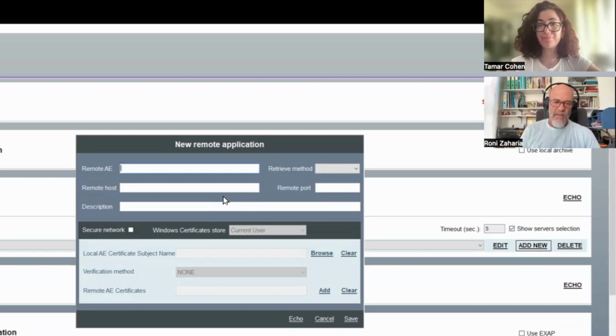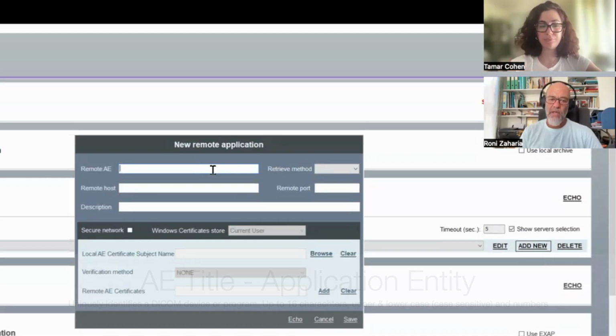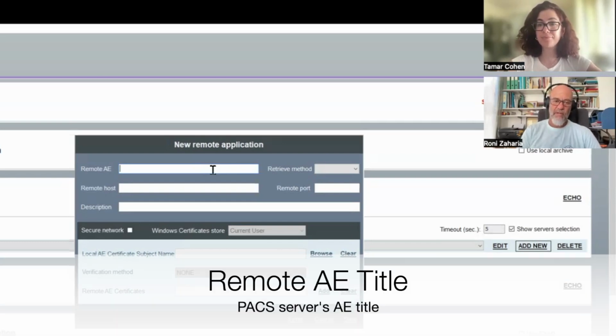Let's start with the AE title. The AE title is the DICOM name of an application in the DICOM network. Every application, every station has its own unique name, so the PACS can identify it. The AE title of our PACS, this is the remote AE title, is Zikit, capital Z.